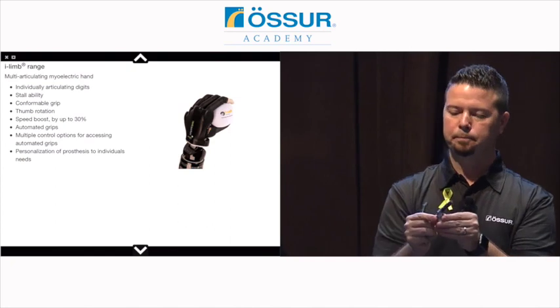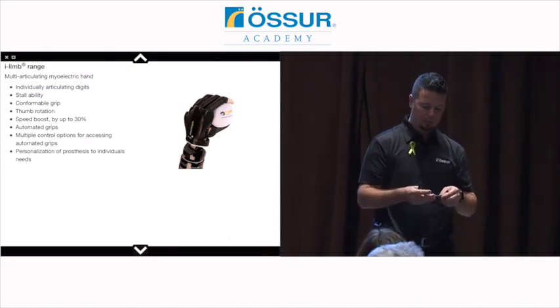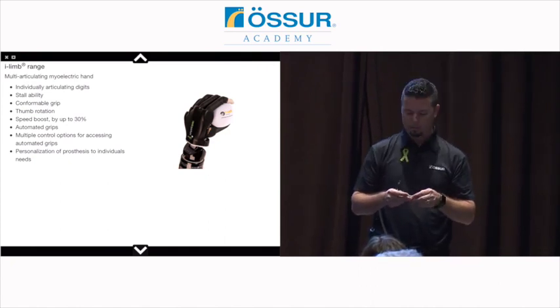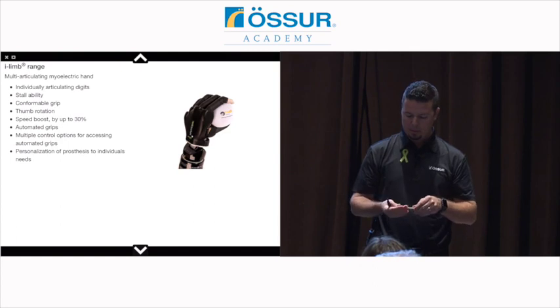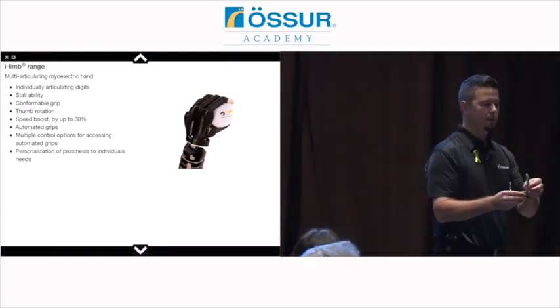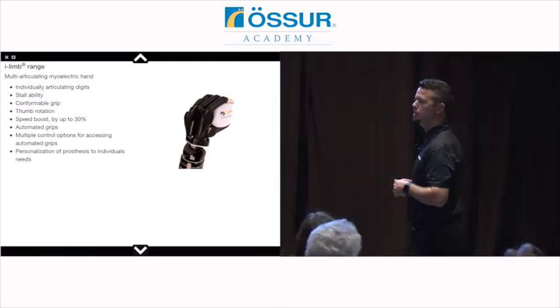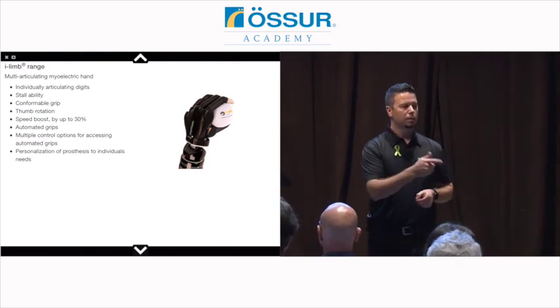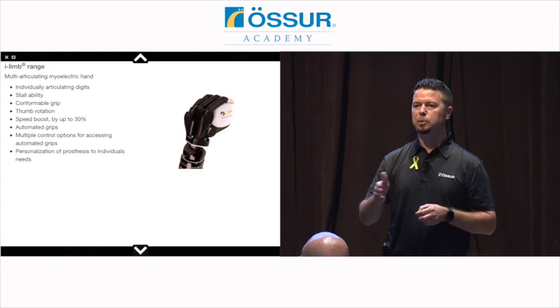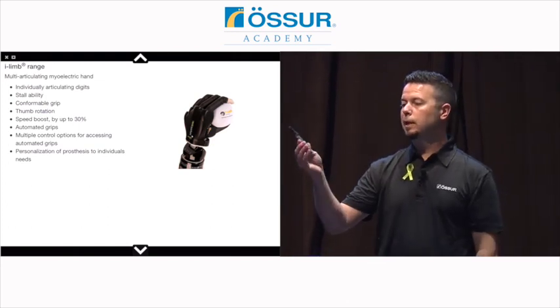It's pretty neat. Interesting note, this technology was invented and was going to be used for children during the thalidomide epidemic. But at the time, the motors and electronic parts and pieces were not miniaturized enough to even make it available for kids. It wasn't until 2007 that it became commercially available, and at this time we still really recommend it for post-pubescent fitting.